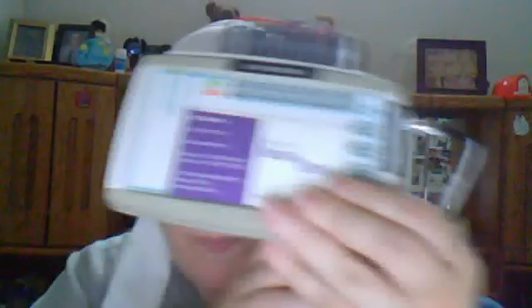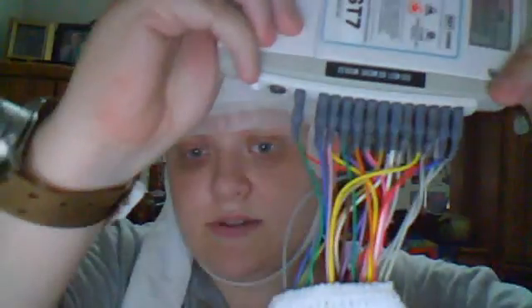In the black bag is a box that holds the electrode wires. I don't know if you can see them, but there are 25.